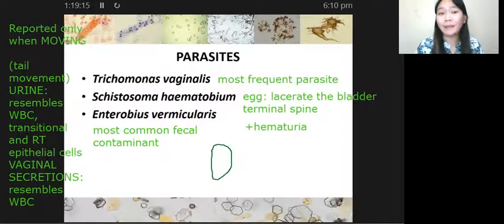Apart from that, kaya nga siya tinatawag na sitworm kasi pag upo ka ng upo kung saan-saan, kinakalat mo na yung eggs. Kung nandun siya sa butas ng puwet mo, mapapasama yan sa brief or panty ni patient, lalo na kung hindi nagpo-follow yung patient ng proper collection procedure.